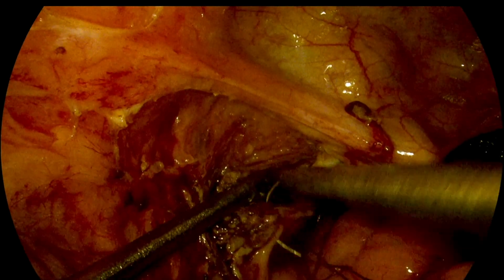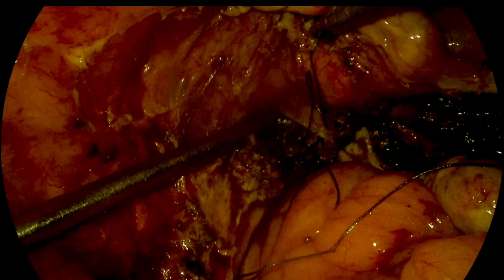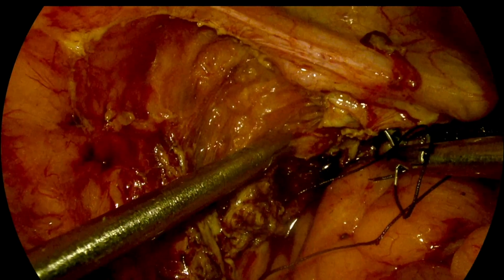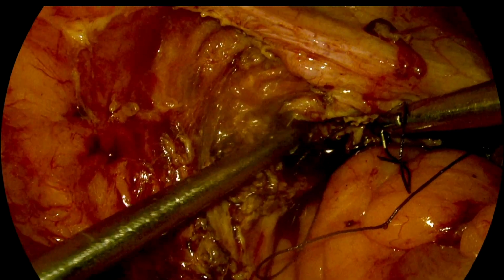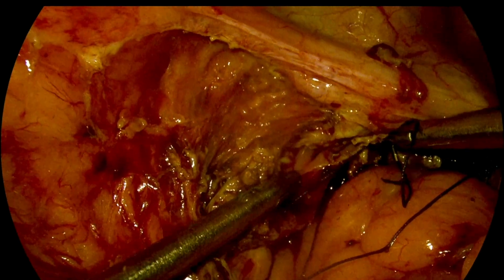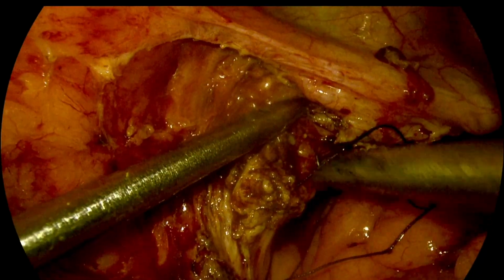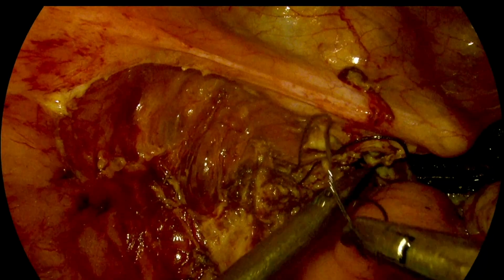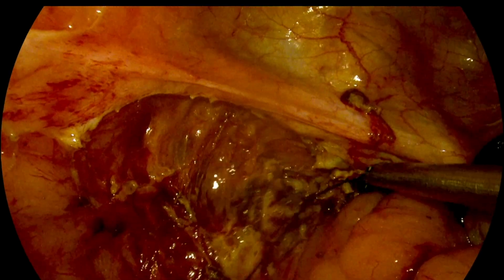So this is the video demonstrating surgery in a patient with previous operations where we anticipate some amount of adhesions and distortion of anatomy. So before continuing the surgery, it is better to reconstruct the anatomy, identify each and every structure before dividing them, and whenever possible, identify the ureter and then the bladder.